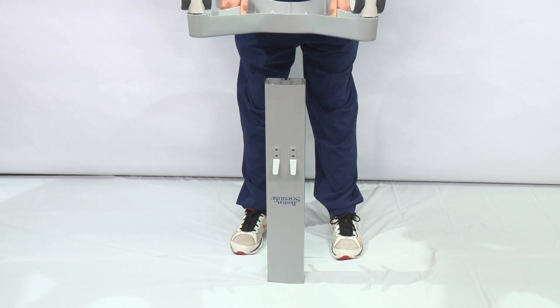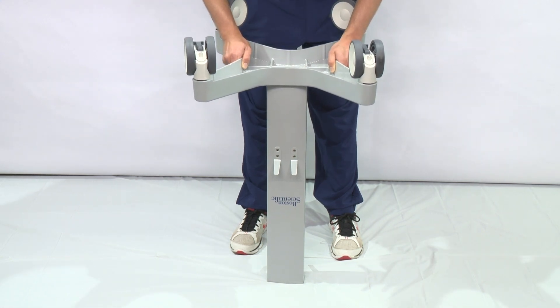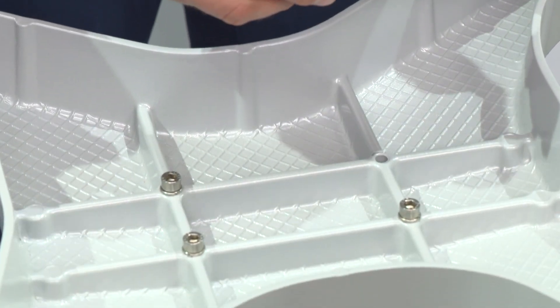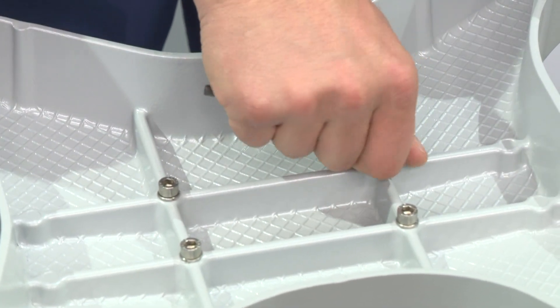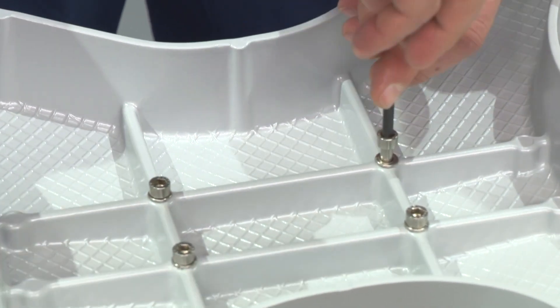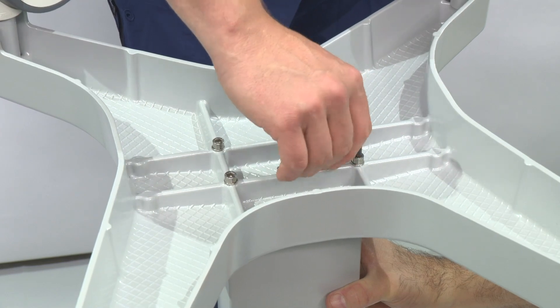Turn the column and base upside down. Place the base on the column, aligning the four holes. Put the screw through the washer, then insert and tighten with the allen key. Repeat with the three remaining screws. Make sure the screws are fully tightened.